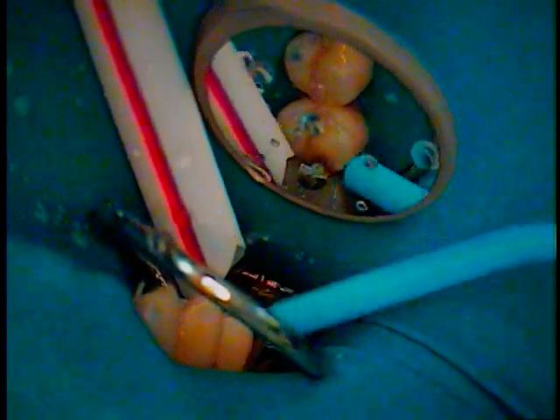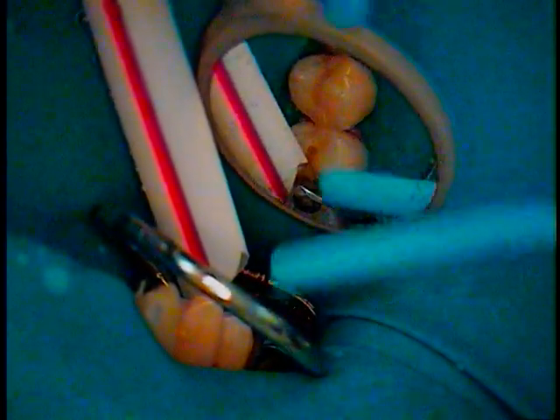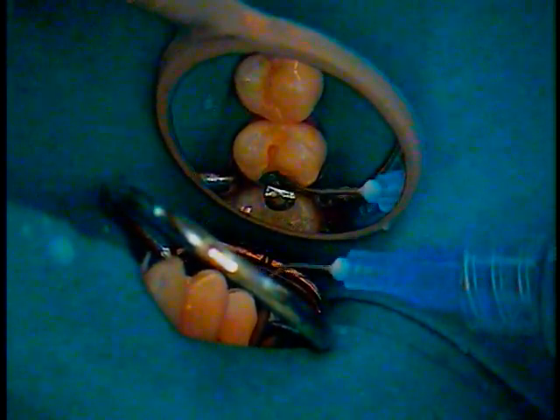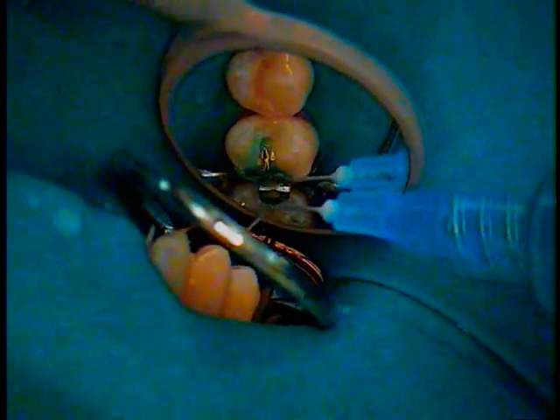And we put it on for 15 seconds and we rinse for 15. Hey, one step causes tooth to be less sensitive over time. So, all right. Now I'm going to go right into etching. Okay, so we're going to etch, this total etch, so I'm going to go right in according to the manufacturer, 15 seconds.